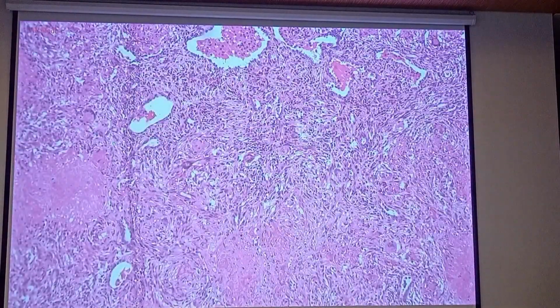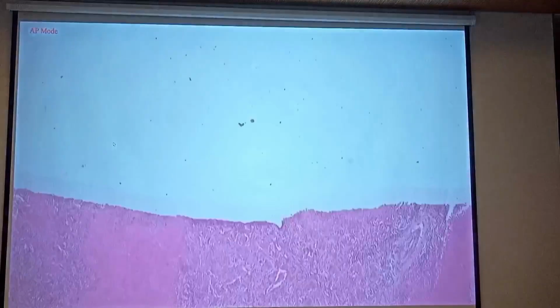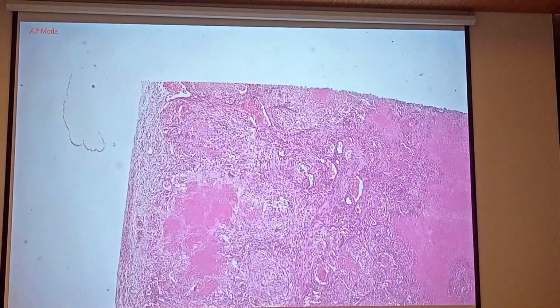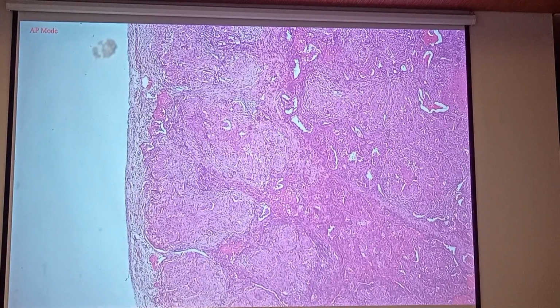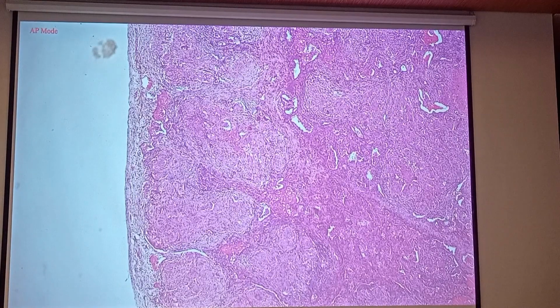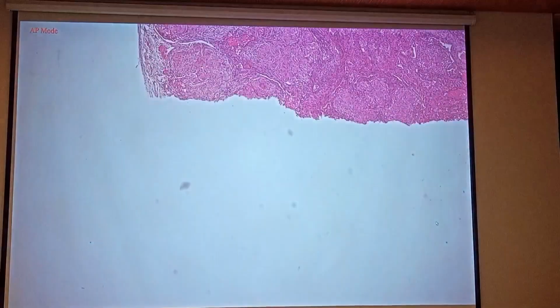Do you see any functional tissue here? No more. Actually, the granuloma formation is very extensive, so I cannot see any part apart from this pleura perhaps. This is the pleura. But this one, I would not tell if it is pulmonary or otherwise.